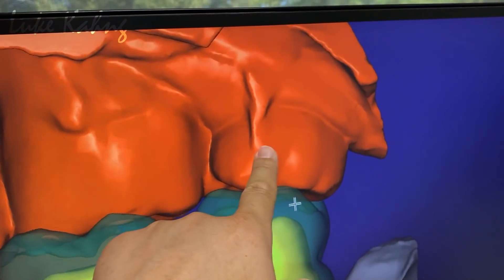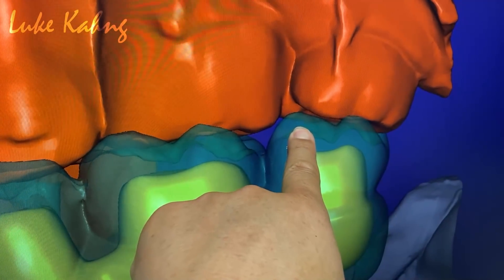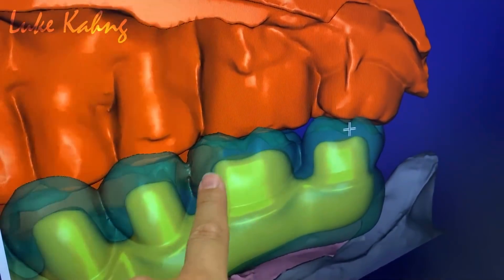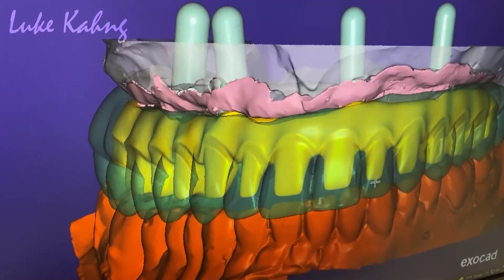Same thing as the natural teeth. Block only this area — that's okay. So we save the tooth eruption. This is getting interference; I'm not going to make it like this — it's too deep. Make it slightly open so they can do it lower in the future. That's good.